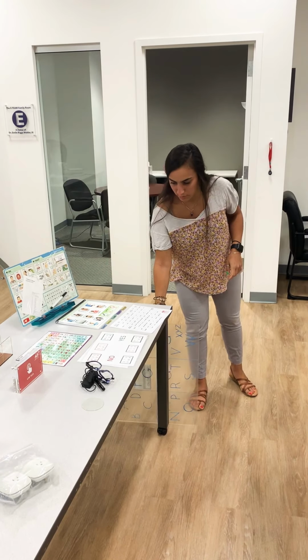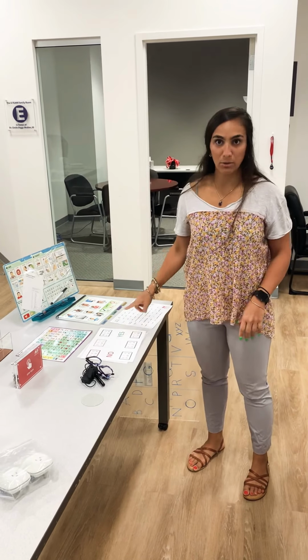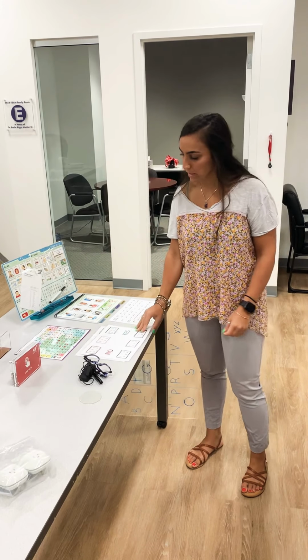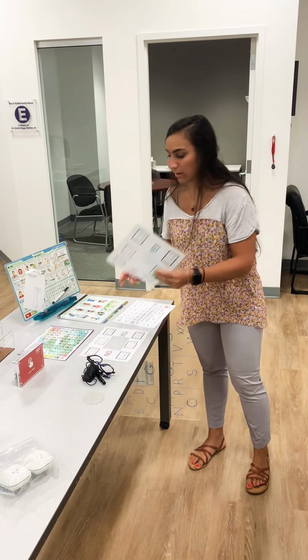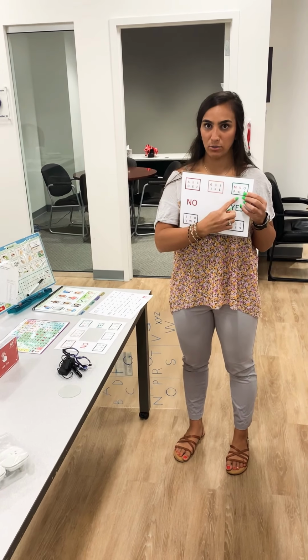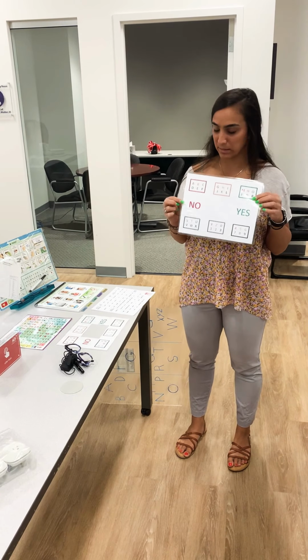When you're using a communication board, if you do still have hand function, you can point to what you want to request. If that's become a challenge and you can't raise your arms, you could always have your caregiver hold up the board for you and point, and when they get to where you want to select, you can blink or just show something to indicate that you've made a selection.